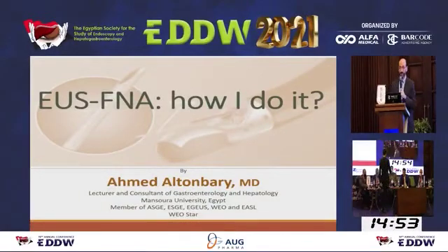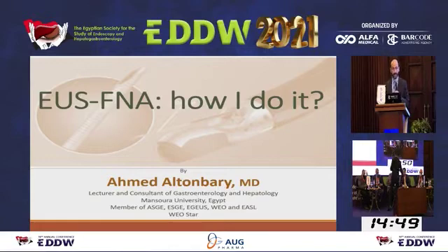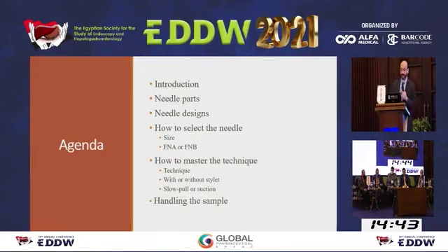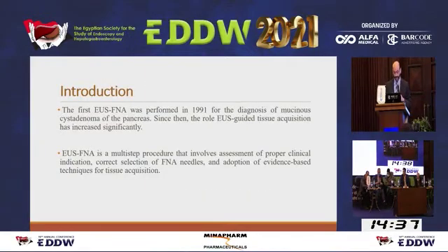Thanks, Chairperson. We'll now move to our presentation about EUS-FNA, how I do it. This is our agenda. We will talk about needle parts, needle design, how to select the needle, how to master the technique, and handling of the sample.